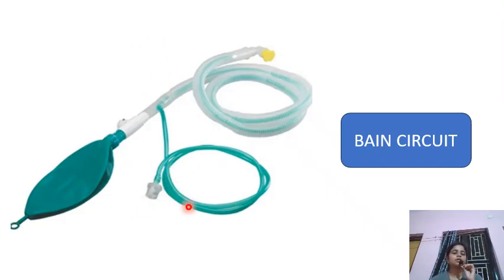Through this, fresh air comes in and is delivered to the patient, and whatever expired air comes from the patient will be collected here. This collected air should be compressed, so that the exhaled gases are delivered along with the fresh air, and this helps to push the fresh air into the lungs.